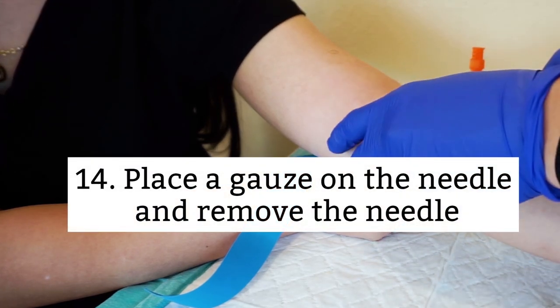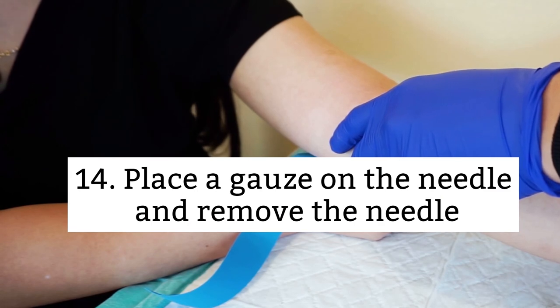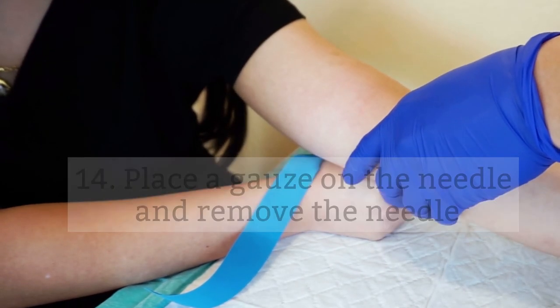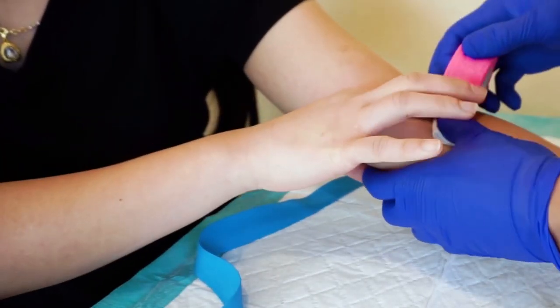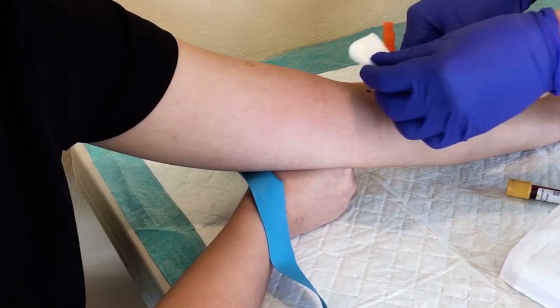Fourteenth, when you draw the last tube, place a gauze on the needle and remove the needle. Do not press down on the gauze because you will press on the needle that is still in the patient's arm. You can also ask the patients to hold the gauze. I usually ask the patient to hold the gauze because that reduces my risk of finger prick as I remove the needle from the patient's arm.